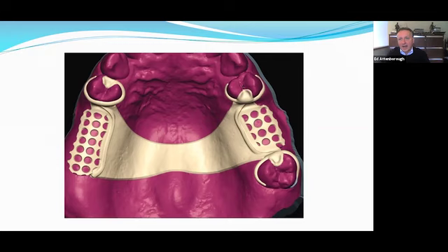Far too fiddly, and really at the end of the day, I suppose you have to ask, when you're in practice, it's about seeing patients as much as possible, and how you value your chairside time. Do you want to spend half an hour? It may be of interest to do so, but does it make sense to spend half an hour designing a partial chairside, or would it make sense just to use the intraoral scanner as an impressioning device, capture the 3D recording, upload it into the cloud, get the lab to do the design, and upload it back to you to download into the practice?